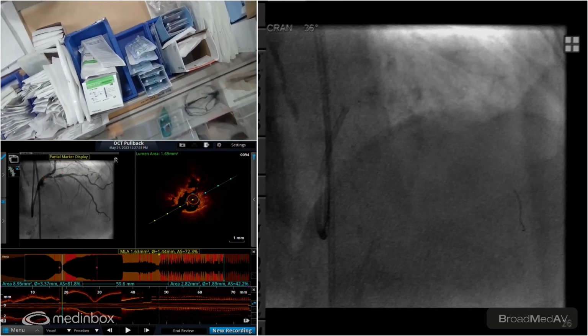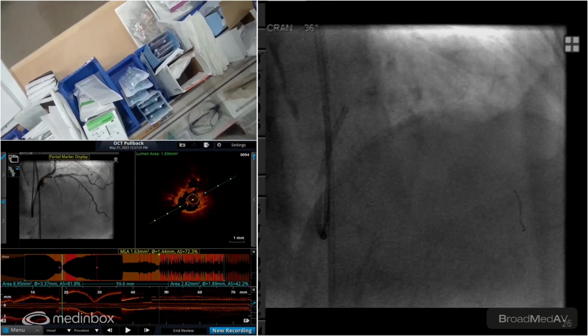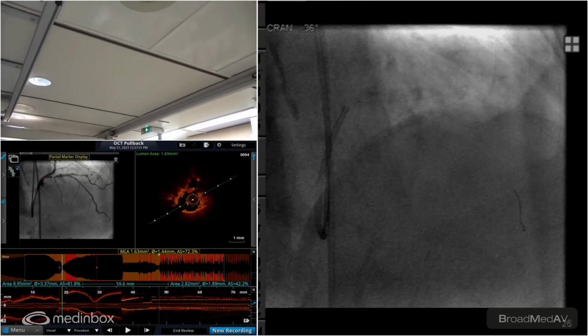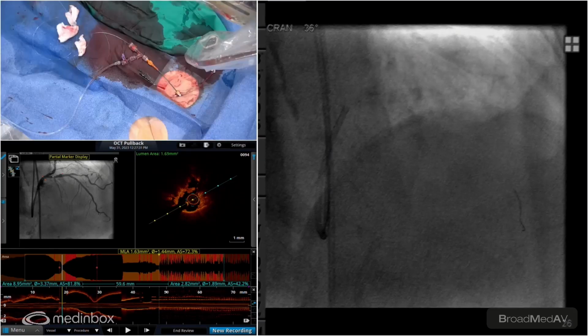You want to do it? I can't see at this age. I can do it. Yeah, let me do it. Yeah, let me just quickly do it. All right, let's get this guy on. Yeah, you're perfect. You got it. Perfect. There you go. Good.